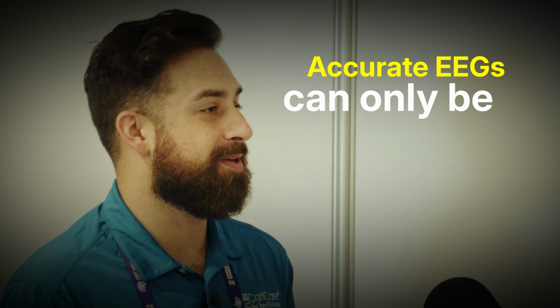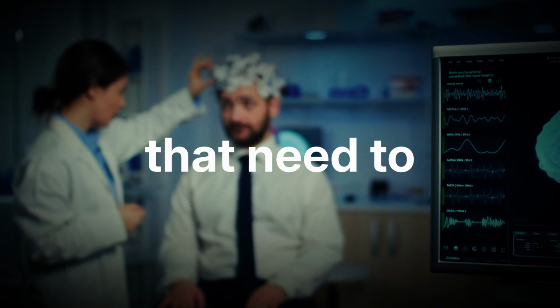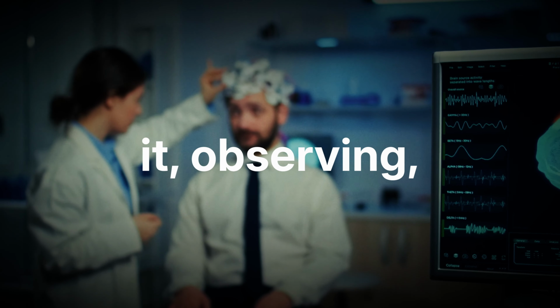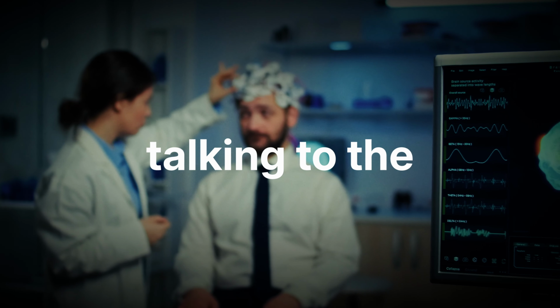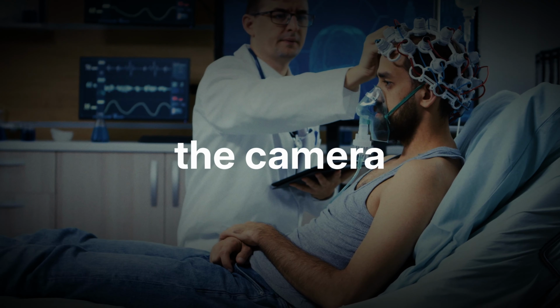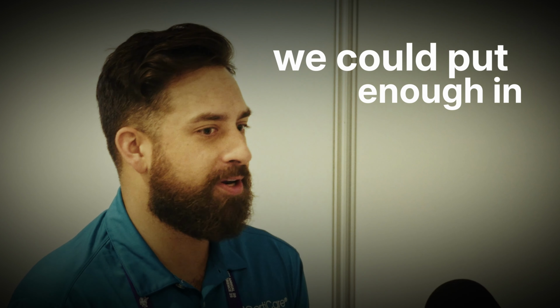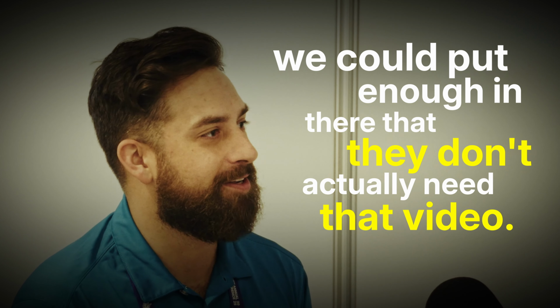Accurate EEGs can only be obtained from accurate setups. You're reporting accurate data, and that starts with us putting the leads on correctly. We're the ones that need to be documenting it, observing, asking questions, like actually talking to the patients, talking to the nursing staff that might be at bedside at the time that can see things that the camera isn't picking up. If we as techs are doing our jobs the best we can, we could put enough in there that they don't actually need that video.